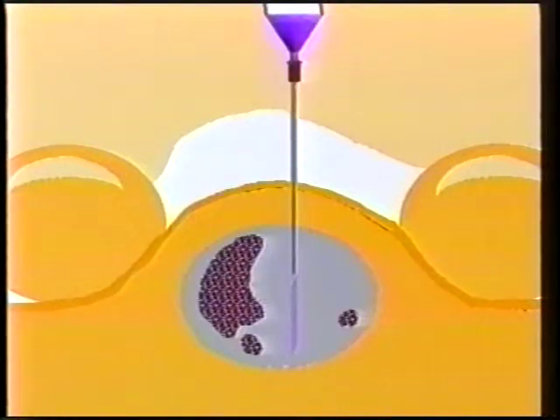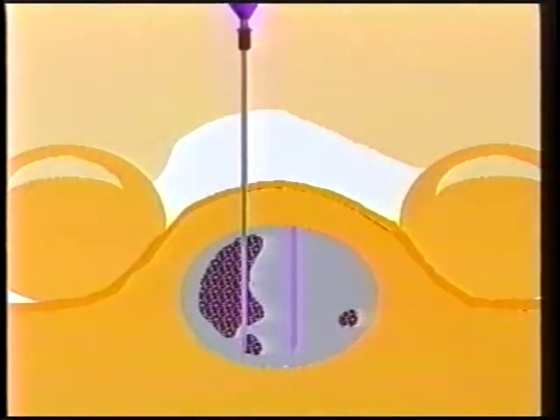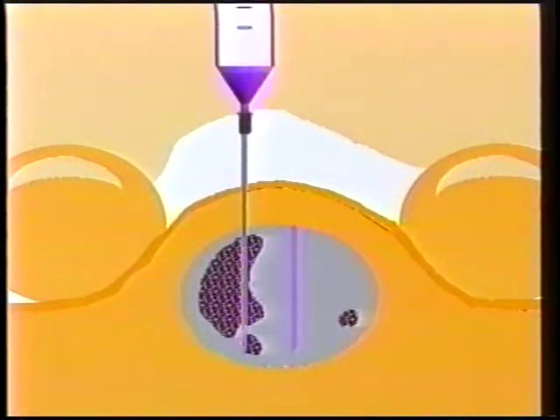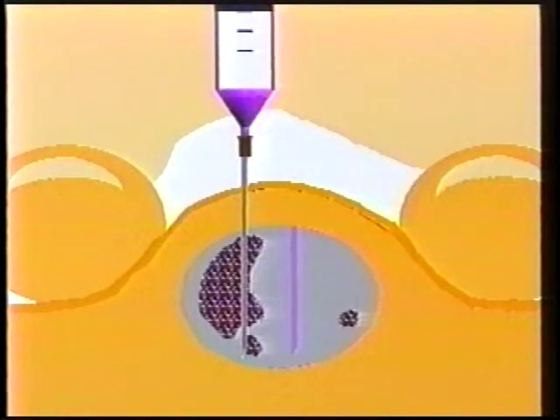In any given lesion, at least 2 samples are taken. Prepare the sample and then, using a new needle, go back and sample another area. This way, you have not only sampled 2 areas, but also avoided re-entering an area previously sampled and likely to contain a small hematoma. Thus, the chances of getting 2 excellent specimens with minimal or no blood contamination are very good. If the mass is very large, several areas may be similarly sampled.